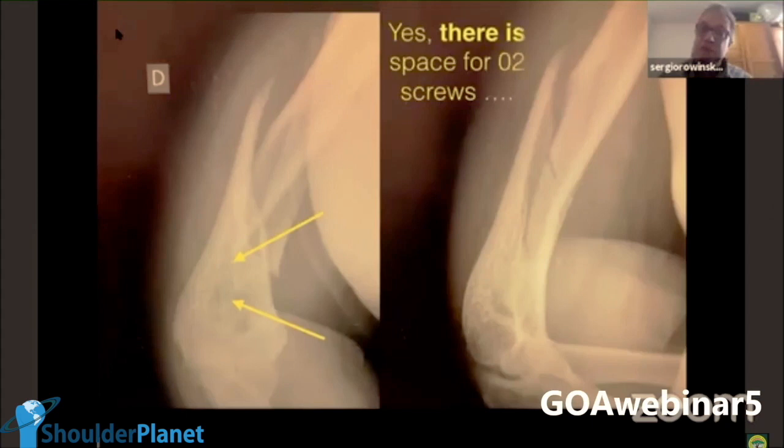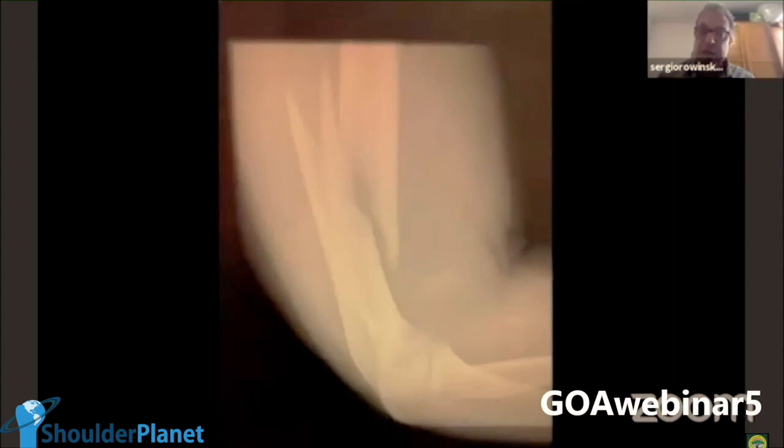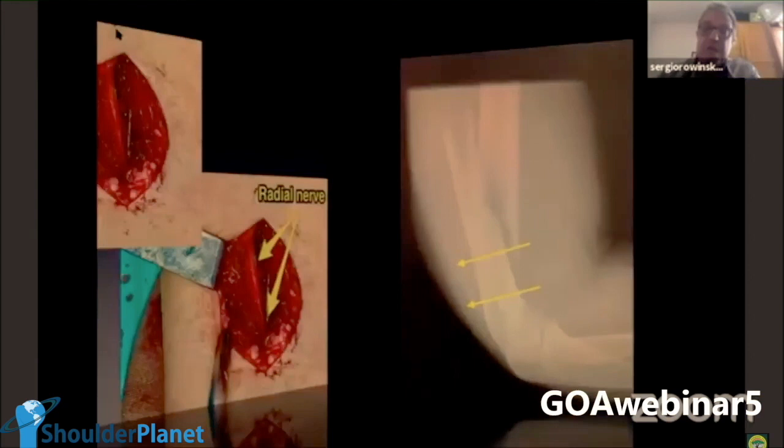So this is, in my opinion, something for people with a lot of experience. Another trick. I know it's difficult to go to the radiology department. I did this with my hands, to have a perfect lateral view in order to see, can I put one? Yes. Can I put two? Yes. So I can do a bridge plate, no space for any mistakes.